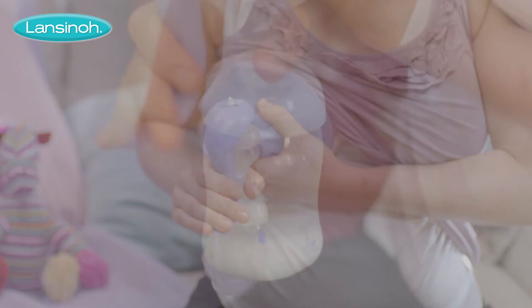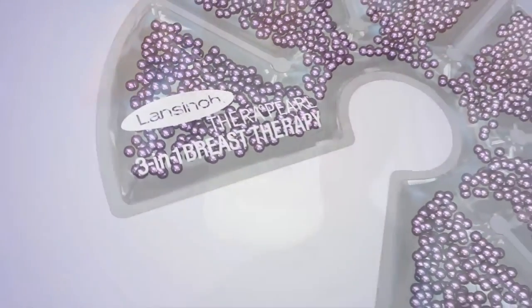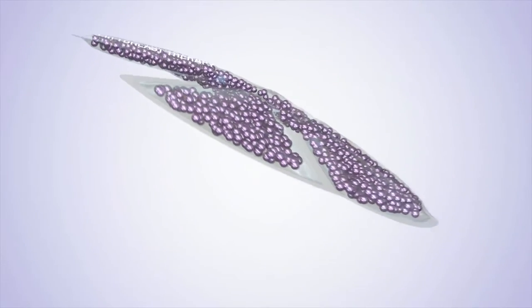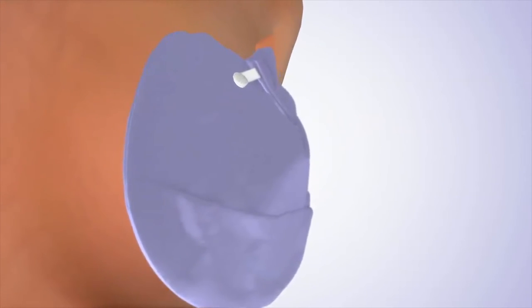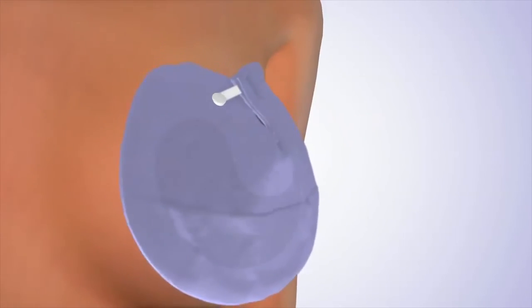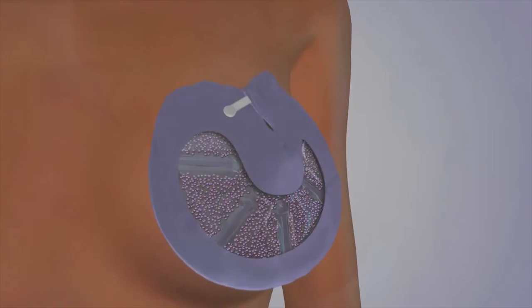Designed by doctors and approved by breastfeeding specialists, Therapearl 3-in-1 therapy packs are non-toxic and reusable for 20 minutes per use, with a technically advanced pearl system that uniquely shapes around the breast to give all-round relief.